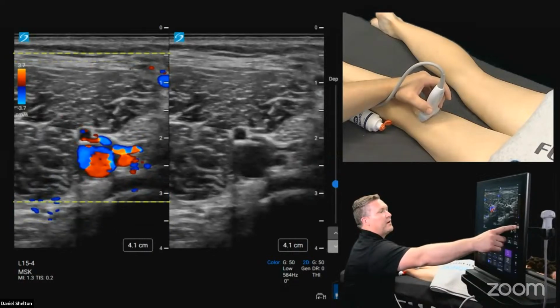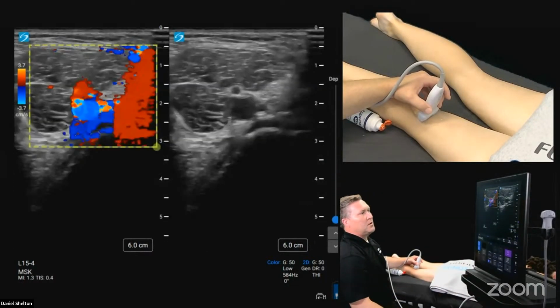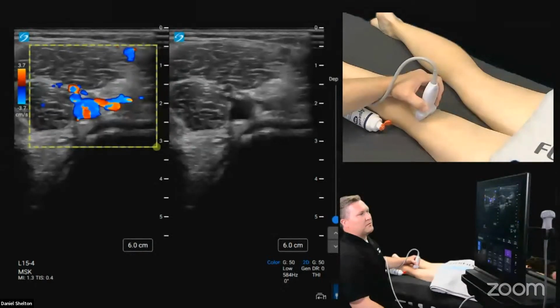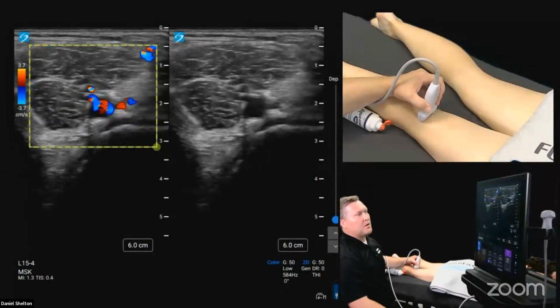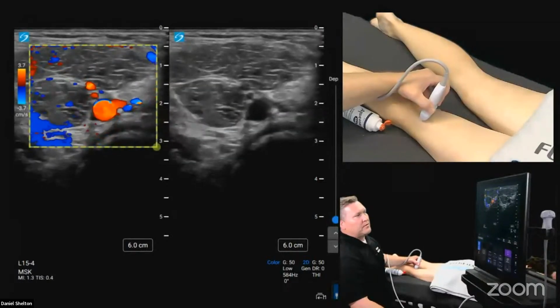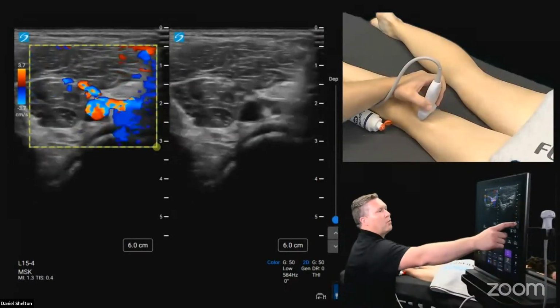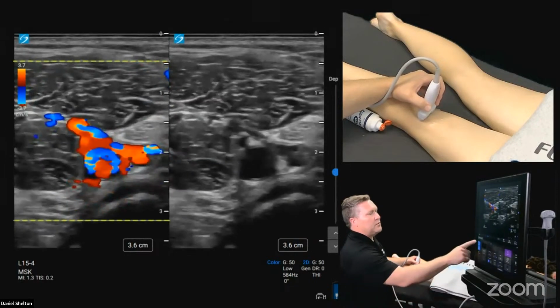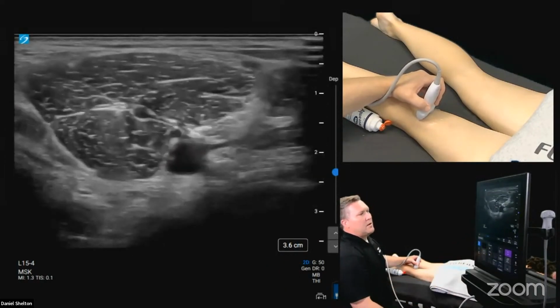So I'm going to bring my depth way down. If you want to capture the full width of the transducer when you're doing that, you will lose a little resolution, just a little machine scanning tip if you're new to the Sonocyte systems or you have not seen the newer Sonocyte systems. I just want you to know the controls of your machine. To get rid of your color, I'm just going to hit 2D, and that'll get us out of anything that we didn't want to have.